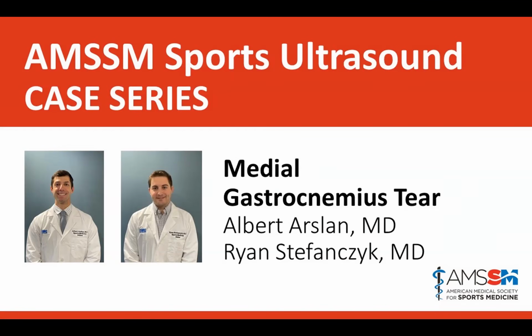And then the only other comment I'll make, and again, Brennan did allude to this previously, but the timing of imaging of muscle injuries is critical. We get this all the time. It's actually gotten better, but we get it all the time where somebody has a muscle injury and they want a diagnostic ultrasound 30 minutes later. And that can really bite you, to be honest with you. These things evolve, and you showed a great series of pictures. Your first image certainly had some pathology there, but on your follow-up, the hematoma was huge, right? So it was very obvious on your follow-up imaging.